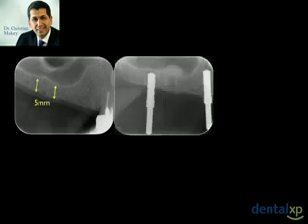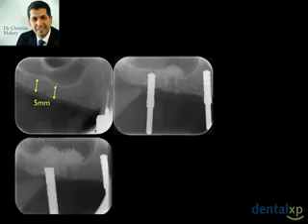Today, with the use of an osteotome, we can try to lift the membrane at the anterior implant site prepared already, and then lift it again on the posterior, and you can see how we have 2 very beautiful dome-like effects.